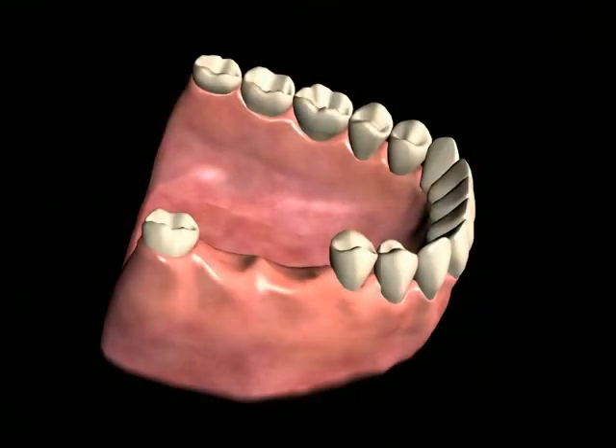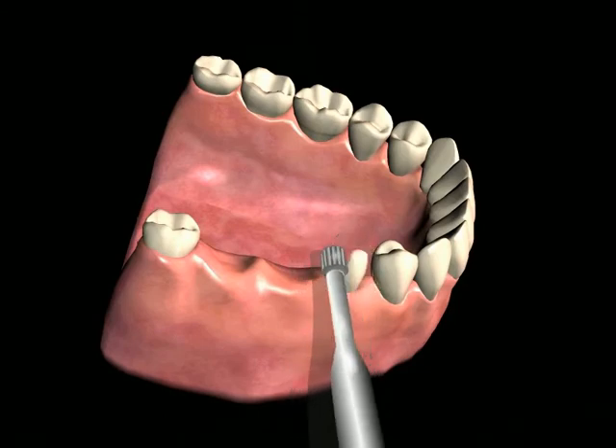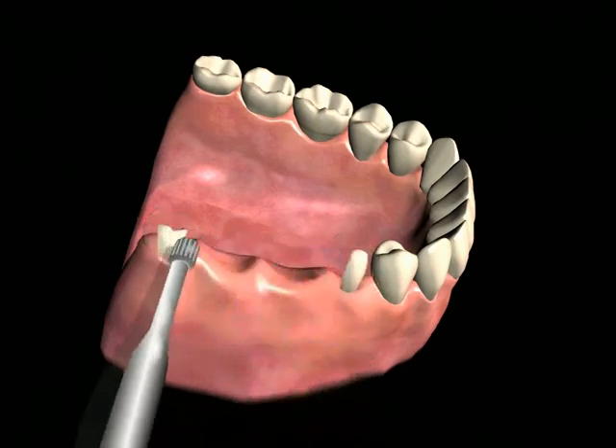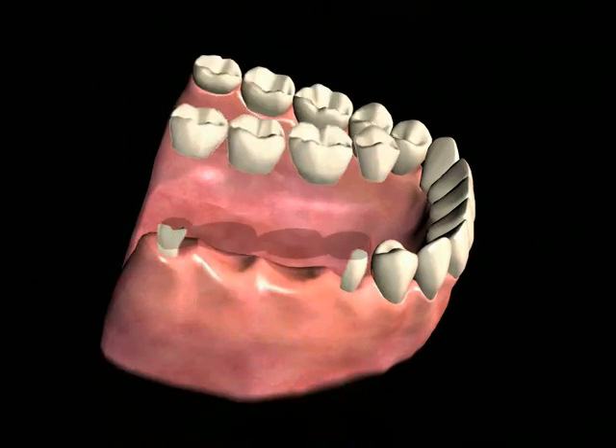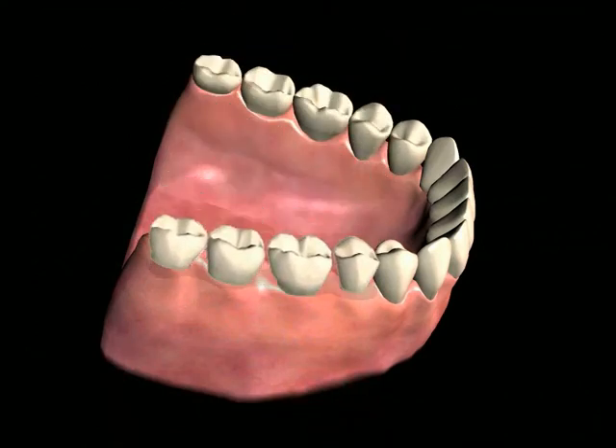In areas having tooth loss, if the neighboring teeth have adequate bone support, an option for replacing the missing teeth can include a fixed tooth supported bridge. This is a non-removable method of attaching replacement teeth to the natural teeth. A fixed bridge relies entirely upon the foundation of the teeth immediately adjacent to the missing teeth. The neighboring teeth used as anchors have to be reduced by grinding to make room for caps or crowns to be fit over the anchor teeth. These caps or crowns are then made to attach to the artificial teeth all as one unit.